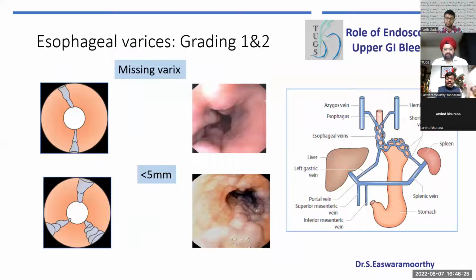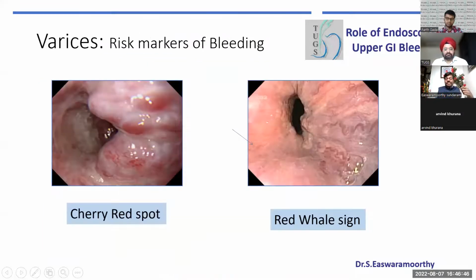We do sclerotherapy very rarely, though it used to be the bread and butter endotherapy in those days, using sodium tetradecyl sulfate, ethanolamine oleate, polidocanol. All those drugs we do have, but how often do we use them? Very seldom, especially for residual varices, very, very rarely.